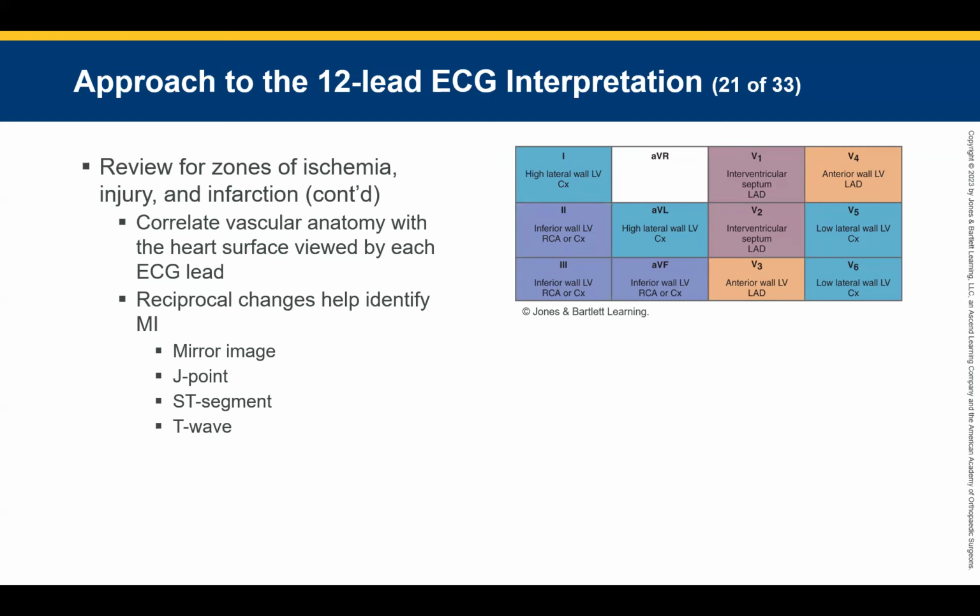Do you have to have reciprocal changes to have a STEMI? No. Is this required? No. Sometimes we don't get the reciprocal. So let's just say we have elevation in 2 or more contiguous leads in our lateral, 1 box or more. We might have a STEMI even though we don't have reciprocal changes with the depression in the inferior leads. I keep saying might. There are like 6 STEMI mimics we have to check for. We're going to do STEMI mimics in a little bit. We will redo them next week. We're going to check for those STEMI mimics every single time.